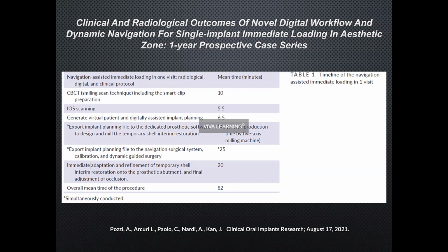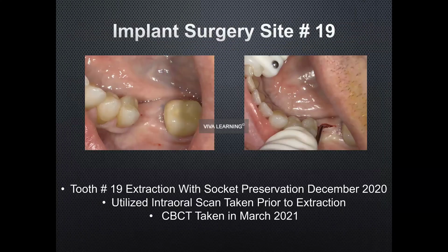I want to have a one and done type of concept with the implant, to where we've done all we can do to design it and get it made to optimal health for the implant to be. So then when we finally restore it, again with prosthetic concerns that need to be addressed, we know that once we place that one, we've done the best we can do. And as long as the patient's body takes over and heals correctly, we're in great shape.